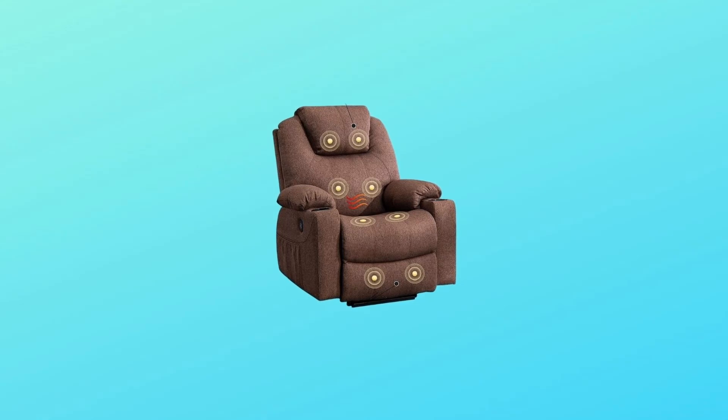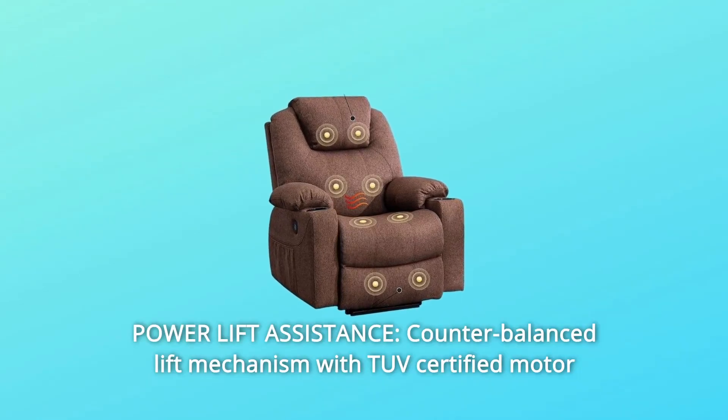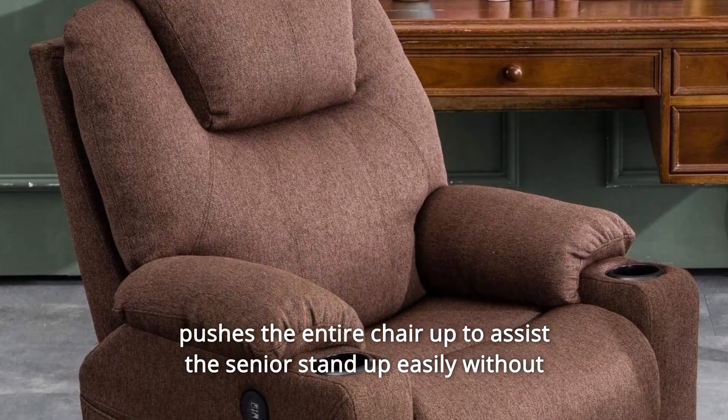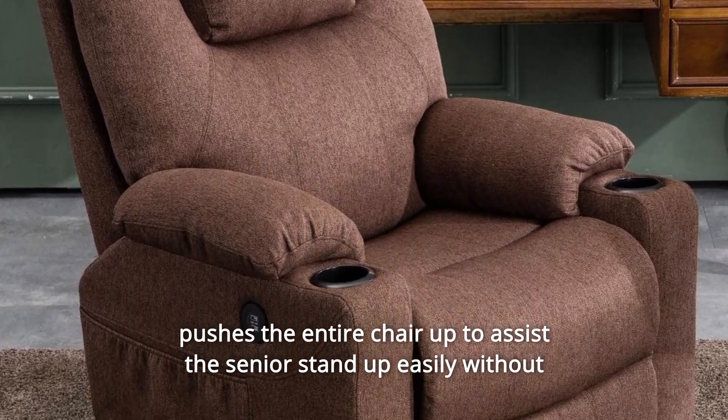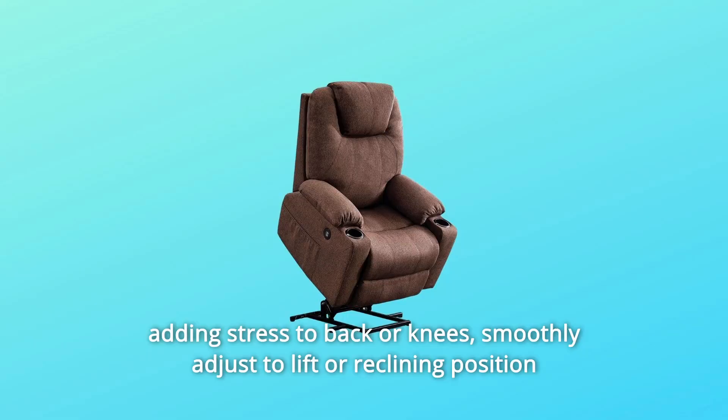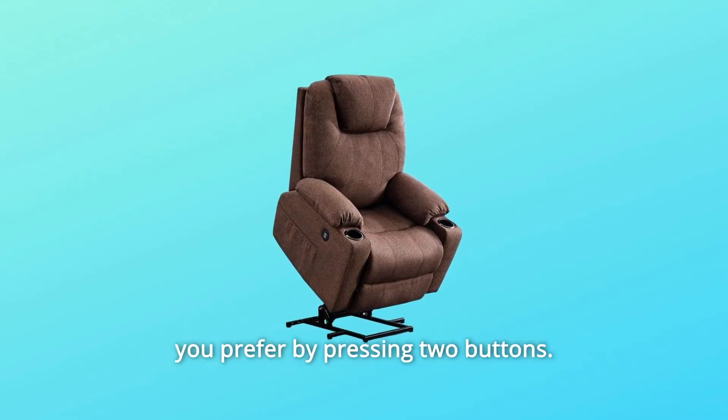Number 3: Power Lift Assistance. A counterbalanced lift mechanism with a TUV-certified motor pushes the entire chair up to assist seniors in standing easily without adding stress to the back or knees. Smoothly adjust the lift or reclining position you prefer by pressing two buttons.